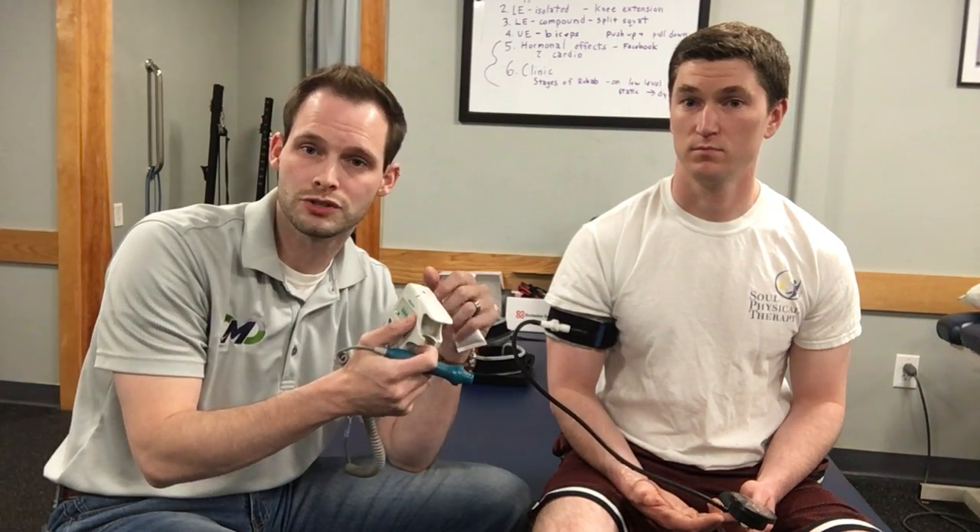The limb occlusion pressure can change day to day depending on the person's hydration and a couple of other factors. I would always check arm to arm and leg to leg, because one arm might be a little bit different than the other. So again, use Doppler ultrasound if you're doing blood flow restriction training to really individualize that pressure.